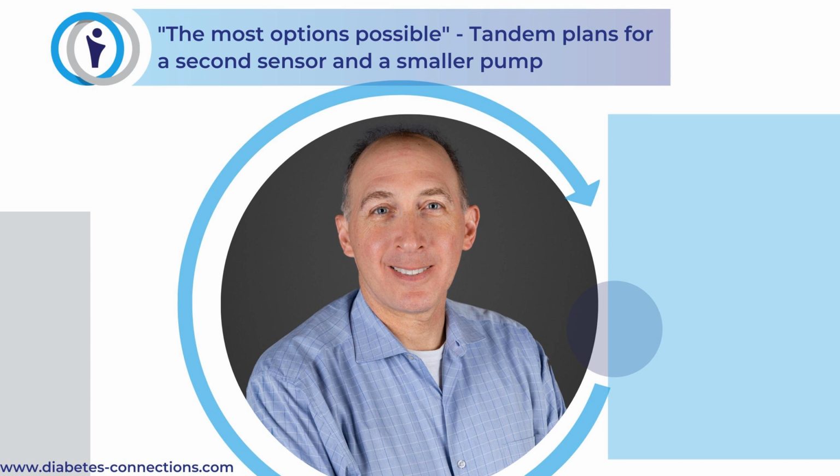And that was great because I think it helped a lot of people. And those are used now throughout the world. What's really nice now with pumps, and especially with automated insulin delivery, is you can fly somewhere, land, and change the time on your pump. For example, if they have Control IQ active, let the algorithm deal with it, right? It'll know your new settings, you've changed the time, but the algorithm every 5 minutes is working in your favor. And we didn't have that in the past. So we made these worksheets for physicians, and it's so nice to see this evolve to the point where we can simplify it, reduce the burden, and let the computer do a lot of the work, rather than us having to do this all manually.